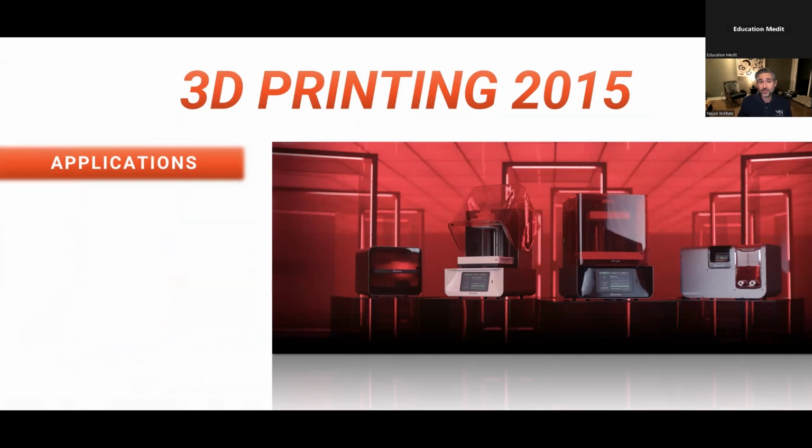I started 3D printing in 2015, and at that time, it was really exciting. I had just started intraoral scanning as well, but the applications were really limited. I was basically doing 3D models and maybe a design here and there that a lab would send me or a DSD lab would send me, but I didn't have much application.